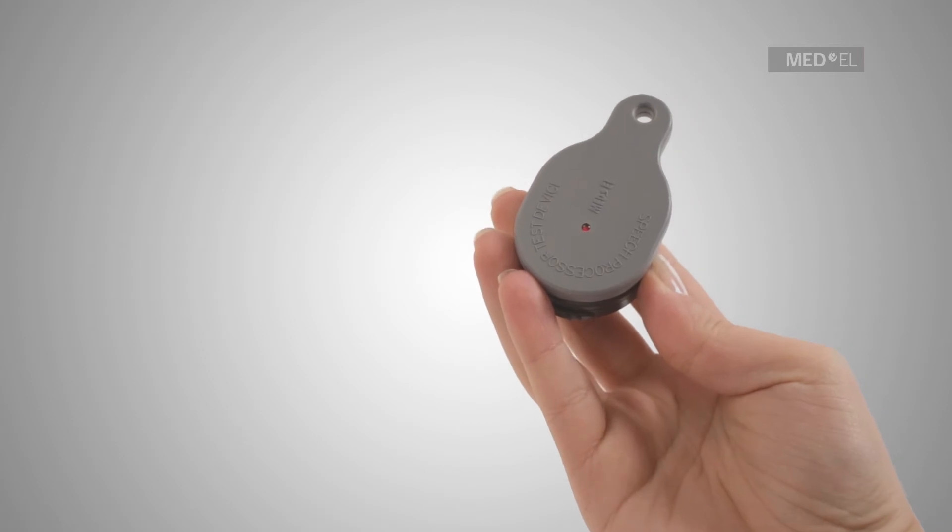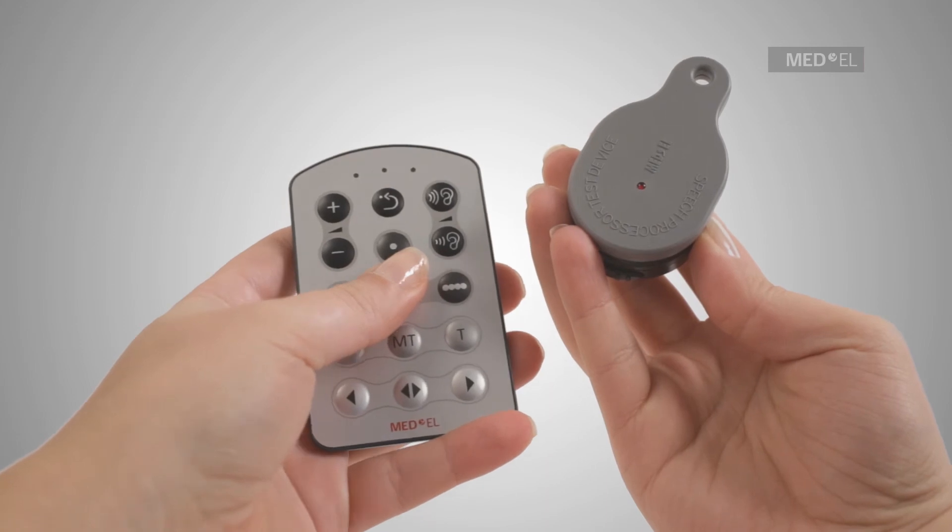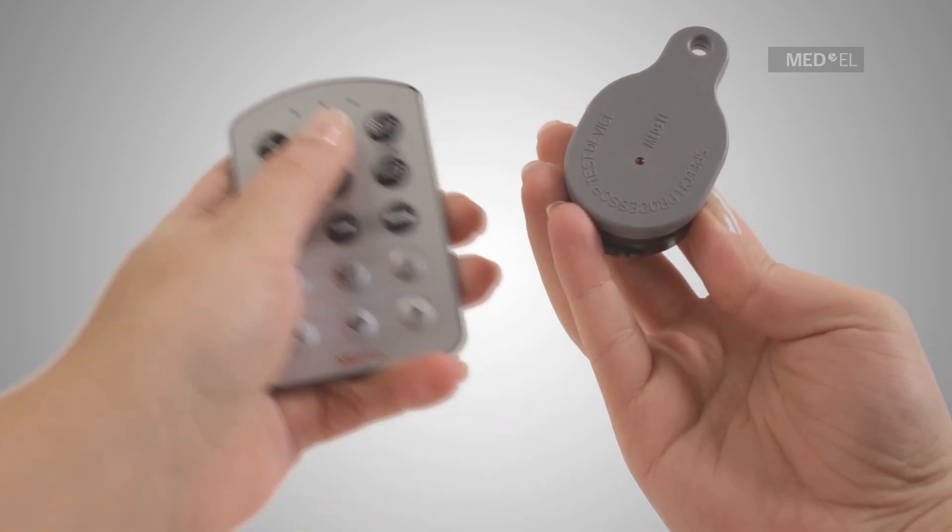If the red light on the Speech Processor Test Device does not flicker or stays on constantly, adjust the volume of the RONDO using the FineTuner Remote Control Unit.